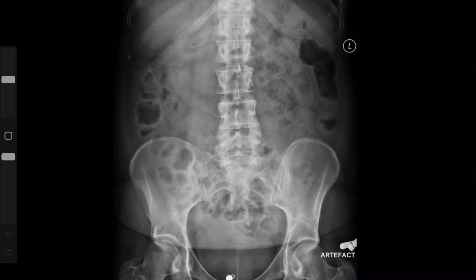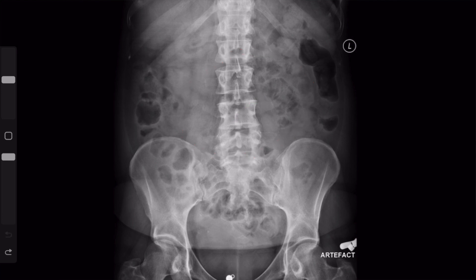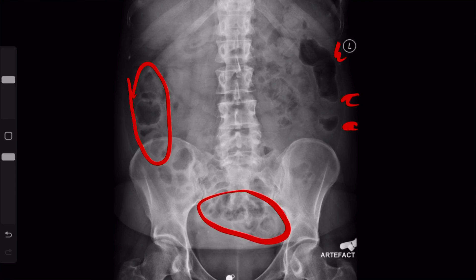This is an example of a normal abdominal radiograph with a normal bowel gas pattern. The small bowel is often located centrally — these are small bowel loops right here. On the periphery you have the large bowel, including loops of colon and some of the sigmoid colon.